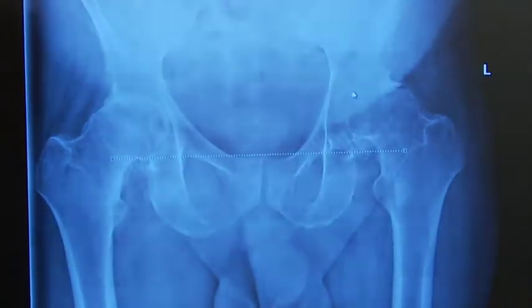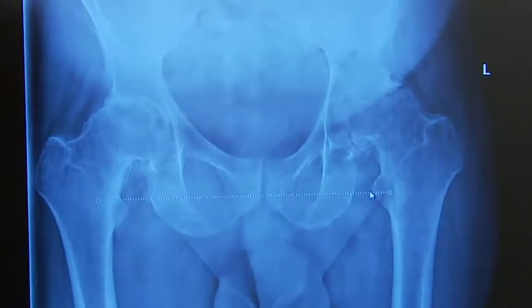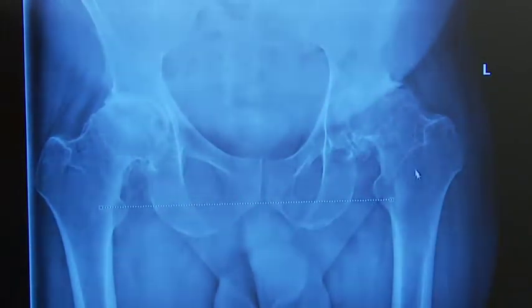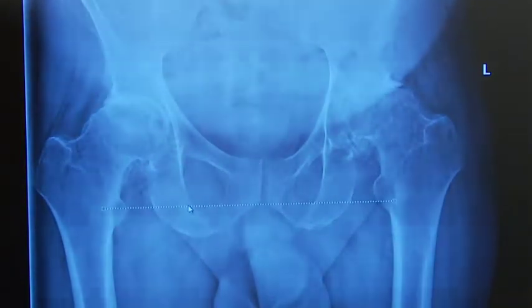The other things you can see is he's got large osteophytes all the way around the cup, a very deformed head and neck, and his hip is quite shortened. If we then drag this trans teardrop line down, you can see that his left hip is quite a bit shorter than his right, probably about a centimeter shorter, but his right hip is also severely arthritic and shortened as well, and so it's hard to know where his hips started and where we need to put them.